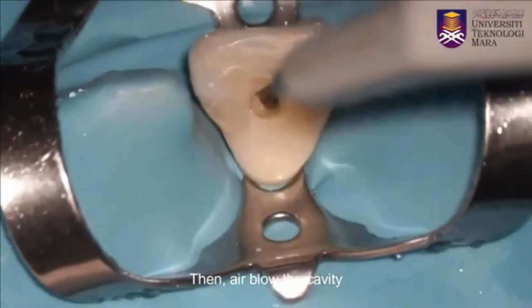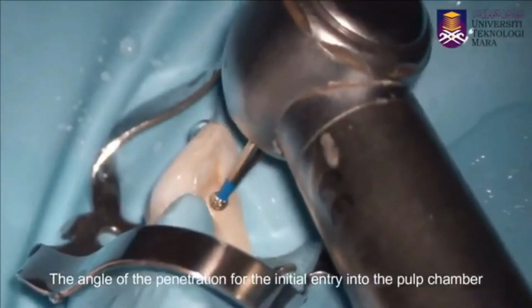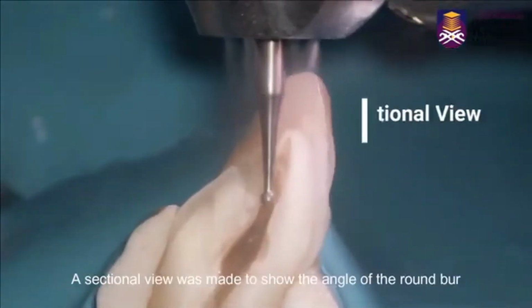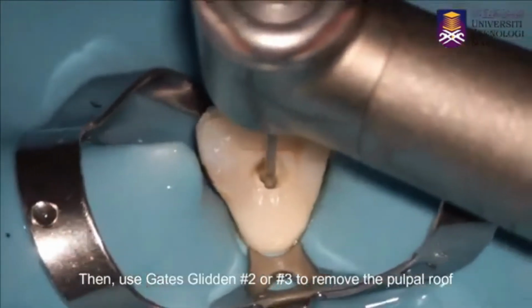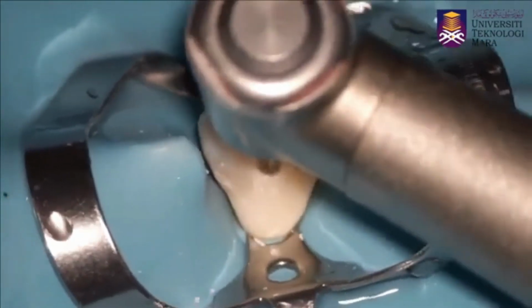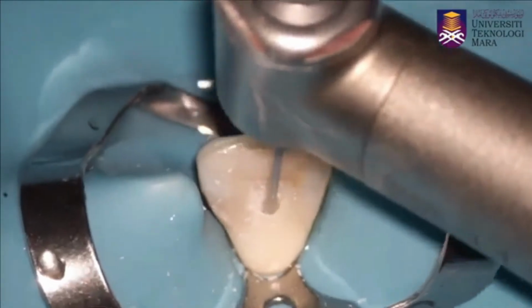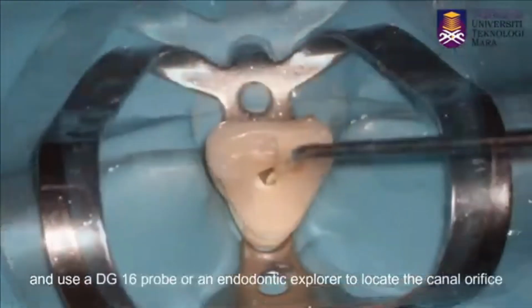in resistance is felt, meaning the pulp chamber has been penetrated. The remaining chamber roof is removed by working the round burr from inside to outside. This is done to remove all the enamel and dentine overhangs that would entrap debris, tissue and other material. Now you can explore and locate the canal orifice using an endodontic explorer.